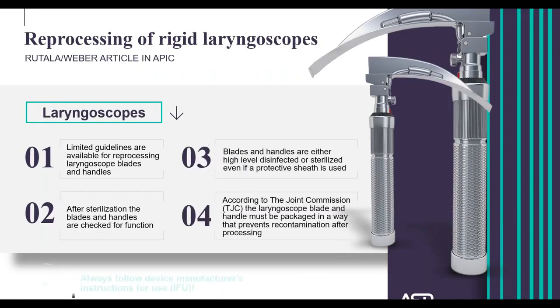So moving from professional organizations to two key opinion leaders that Janet previously mentioned, and again, many of you are likely familiar with, Dr. Rutala and Weber. According to Rutala and Weber, most infections associated with reprocessing of medical or surgical instruments involve high-level disinfection of semi-critical devices. And I think we've all heard the statement, there is a very small margin of safety when it comes to reprocessing endoscopes. And again, I think we just need to think back to the comments I made around AAMI Standard 91. And part of why they likely have made that recommendation around sterilization is the greater margin of safety built into sterilization.